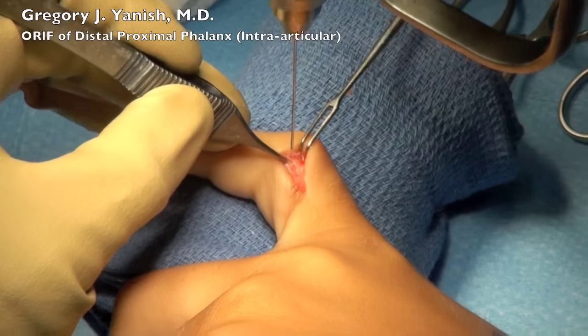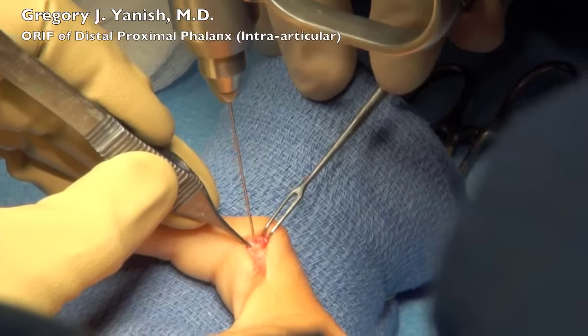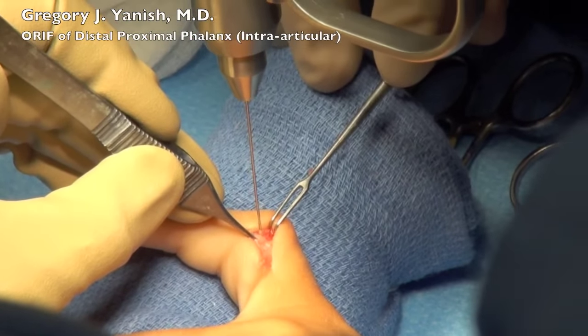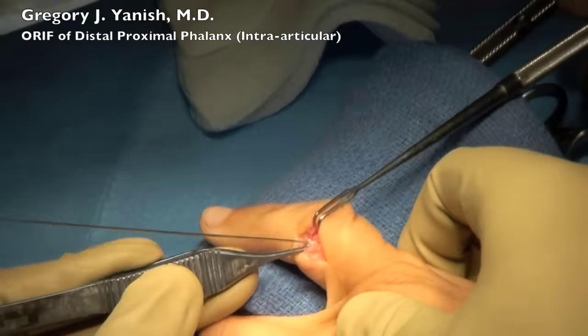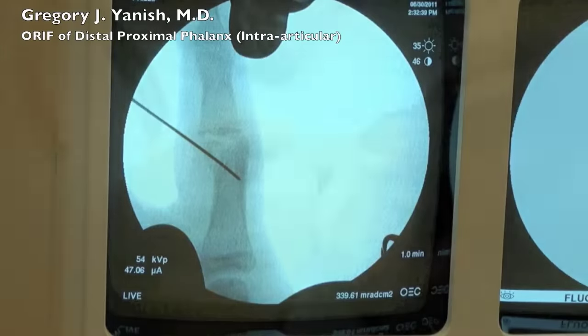The x-ray you just saw was me testing the location of that fracture segment, and now I'll be placing a pin through the fracture segment and into the bone across from it to hold it in place. Once that's placed, I'll confirm its positioning with the fluoroscopy. You can see there that that's holding up quite nicely.